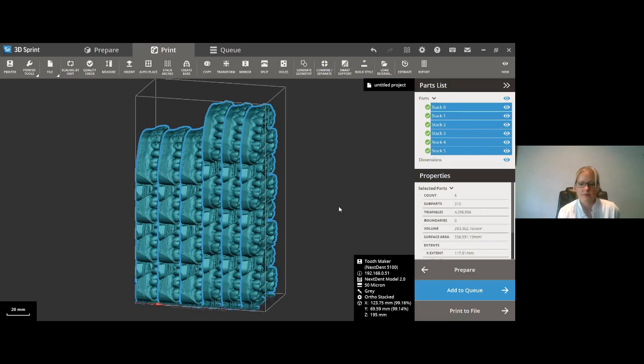As far as I know, the difference between the X and the Y axis is due to the fact that we also have a different amount of pixels in the X and the Y axis. And since this is a percentage, this is recalculated to that. So that's the smarter answer that I can come up with. I was hoping you could add something to it. If not, we can always find out a more solid answer later on.